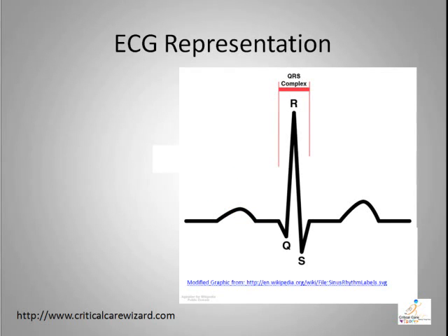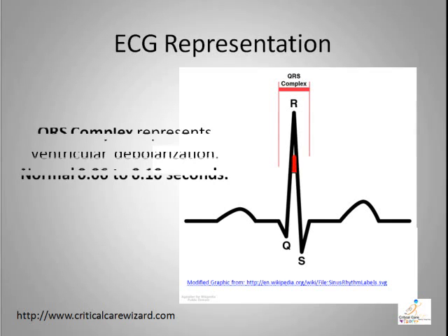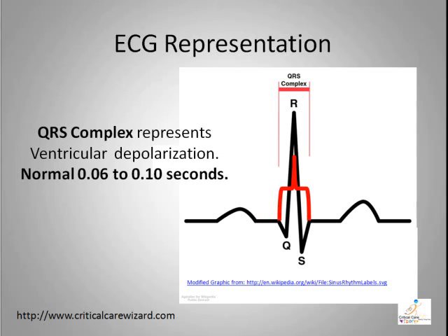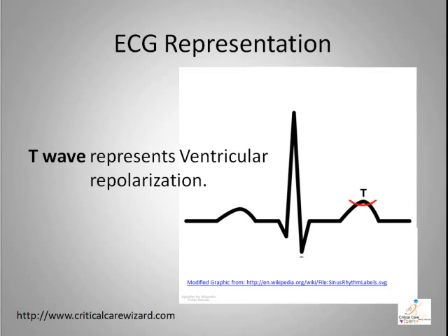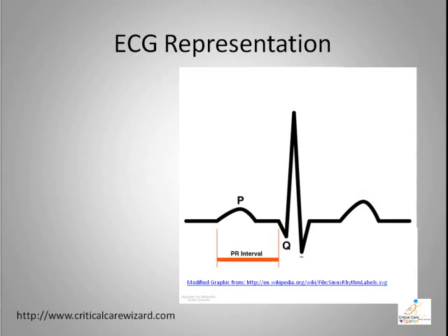Ideally, after the atrial muscles have been depolarized, the ventricles are depolarized next, thus creating a QRS waveform. It is referred to as QRS duration or QRS complex. When the ventricle muscles return to their resting state, a T wave is created.